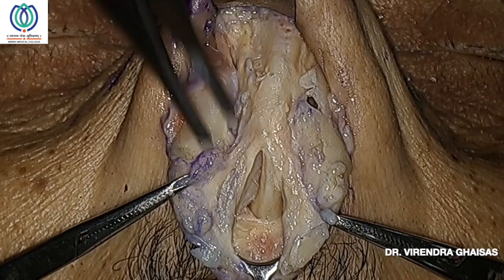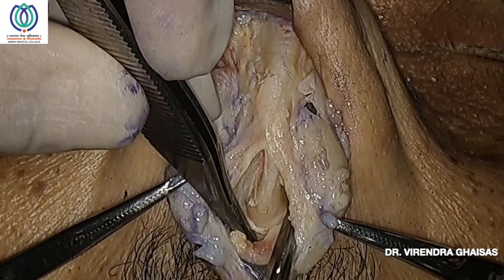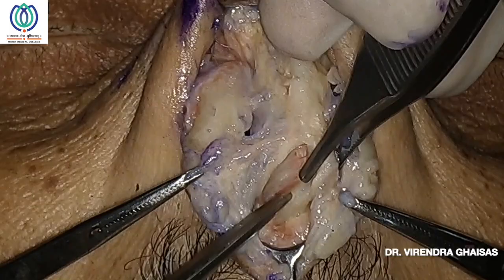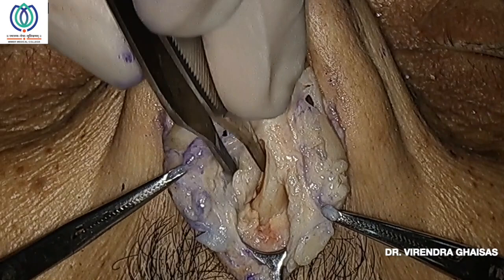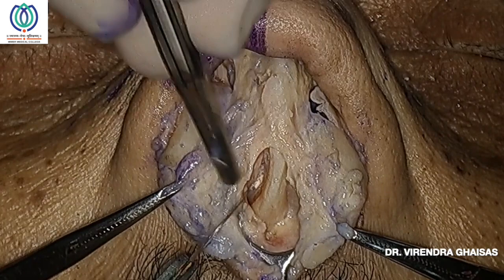Just cut the perichondrium without cutting the cartilage, and then you can get a good subperichondrial plane. You can see again the anterior maxillary crest or the spine there too, where the cartilage is sitting on the spine. During live surgery, ask the assistant to hold the septum to keep it straight, and with a scissor just dissect it and go into the subperichondrial plane, and later on you shift to the suction elevator so that it becomes very easy to do a subperichondrial dissection to expose the bony cartilaginous part of the septum.